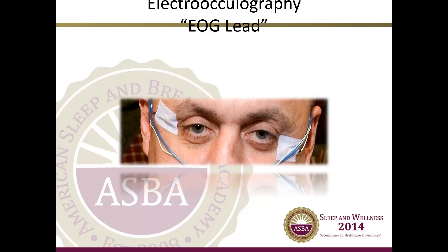The electrooculography, or EOG, leads record eye movements and assist in determining sleep staging. These leads include E1 and E2. The E1 lead goes out and down from the outside corner of the left eye and is placed on the left outer canthus. The E2 lead goes out from the outside corner of the right eye and is placed on the right outer canthus. Gold cup electrodes are most widely used for this recording; however, clip or snap electrodes are also used. We encourage you to review your lab's protocol.